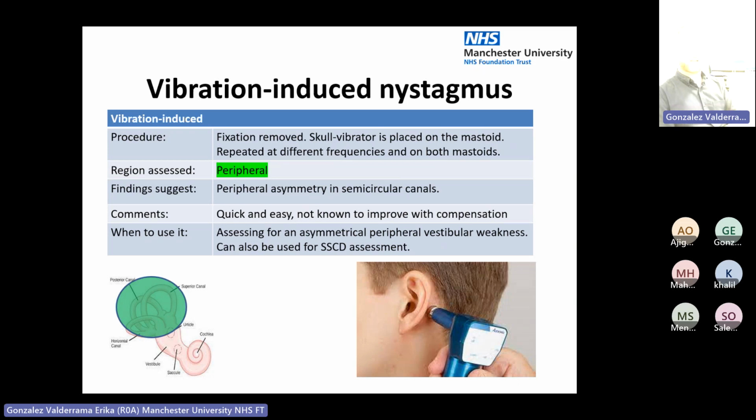But this is really handy, and I'm going to start taking this into the ENT clinic that I do with Emma, where we just rapidly go through new patients, because we already do it with the V-HIT, where we can very quickly check their vestibular function. But if you add this to the V-HIT, it increases the sensitivity of the battery.